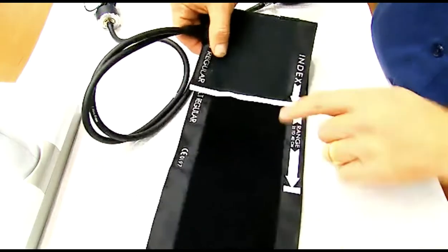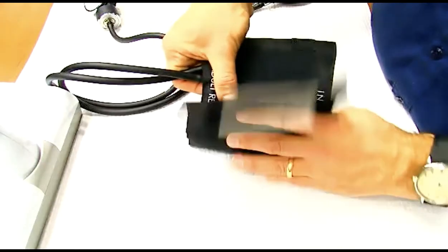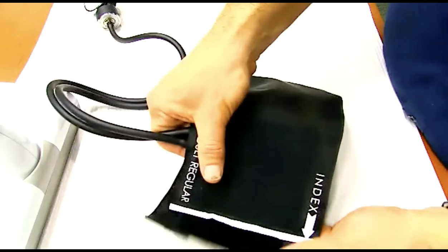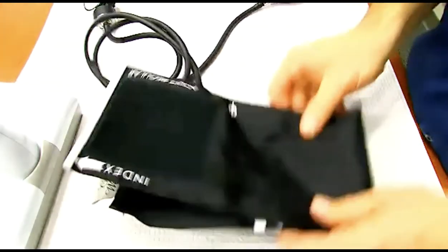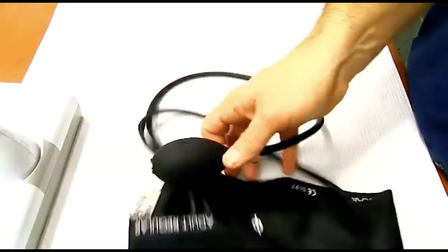But that's what this range marking on the inside is, so that when you wrap it around, watch where the white edge of the end ends up, and it should be somewhere right around there before you flip over the Velcro, okay? If you're over here, that's too small. If you're way over here, that's way too big, okay? That's really it. That's all I got to say about the blood pressure cuff. So again, markings here, you got your manometer, and you got your pressure valve. All right, let's set these aside and move on to your stethoscope.